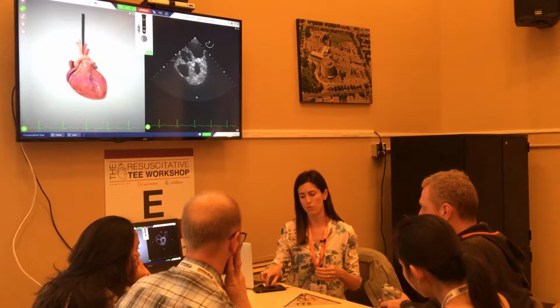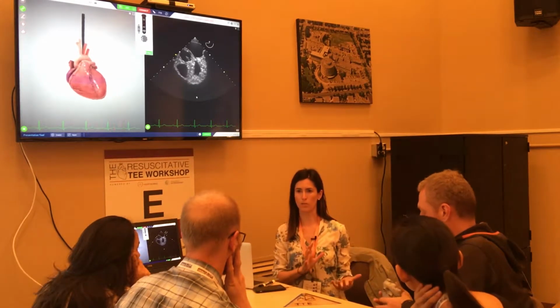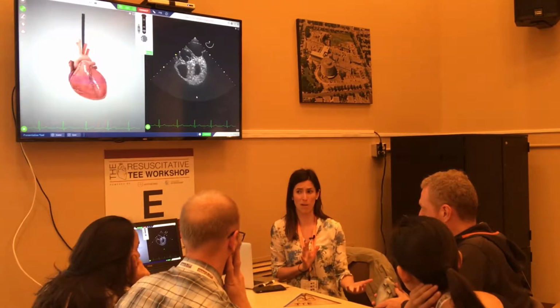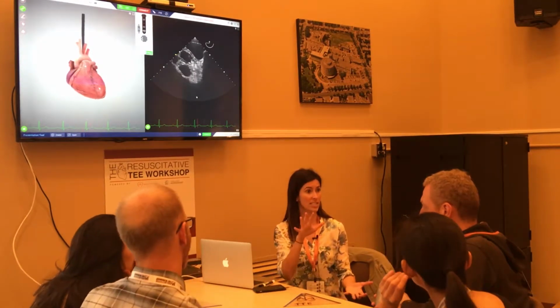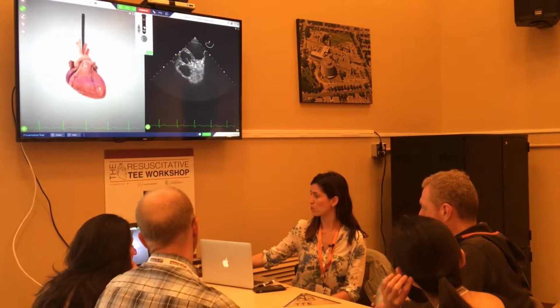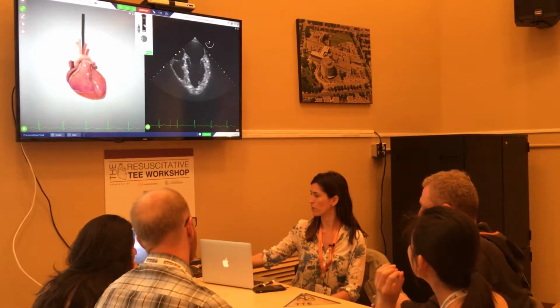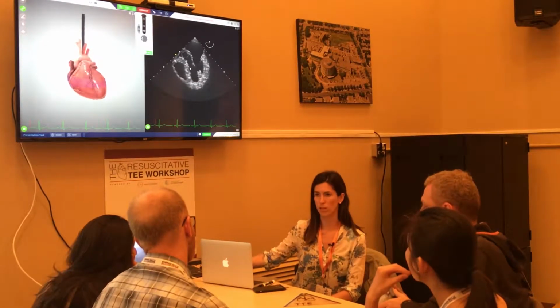On transesophageal echo, knowing that you are the probe and the heart's in front of you, where is the apex located? Is it located close to you or is it further away? Further away. So that kind of helps to explain why we're going to see that mitral valve first before we see the tricuspid valve. So all I'm doing here is advancing the probe a little bit further. I start to see that mitral valve first, and I see this aortic root, okay?